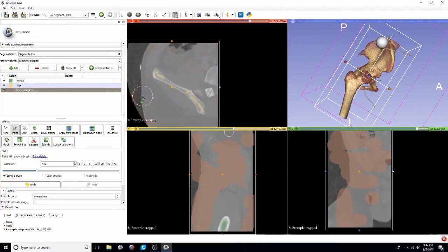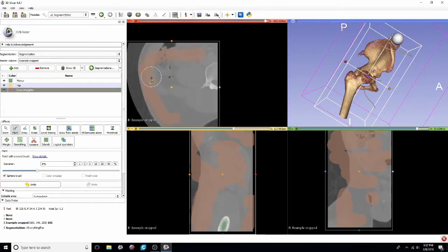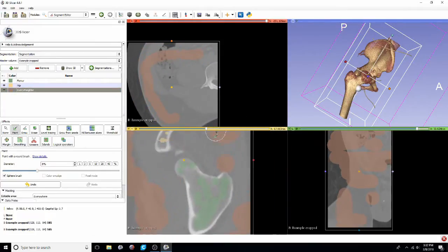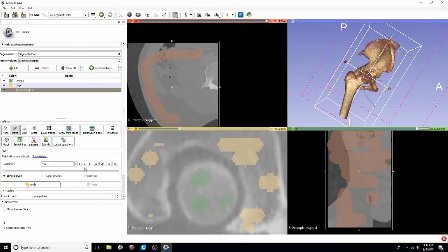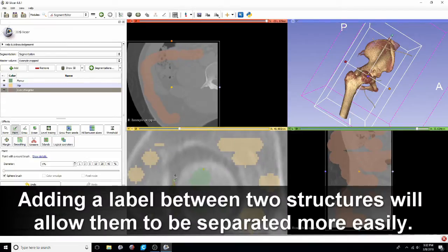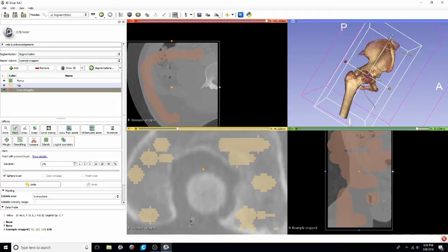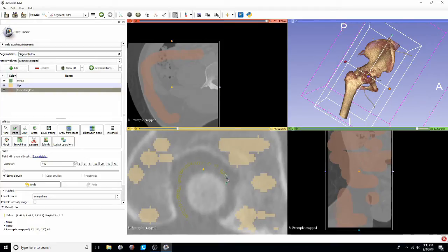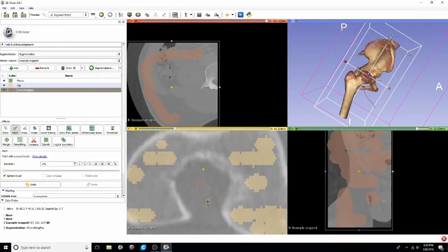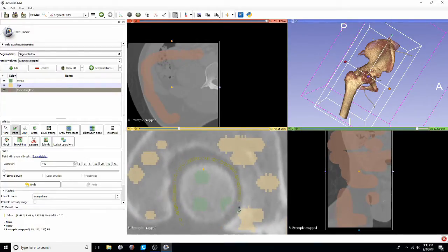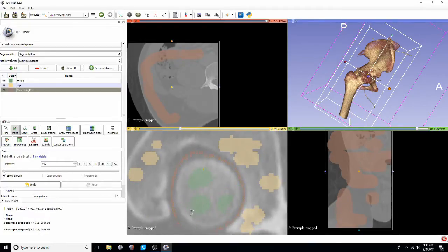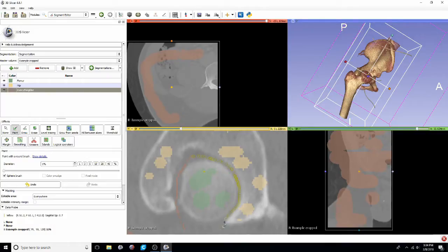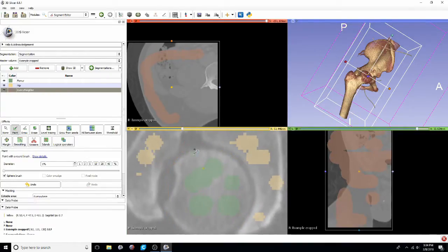But don't go too crazy with spending a ton of time. I've also found that adding a label between two structures allows them to be segmented out much better. It really gives the computer an idea of where that femur ends, what is in between them and then where that hip starts. The computer will kind of automatically figure out that everything else is the less bright structures. The femur is this brighter structure and then the hip is the other bright structure, but on the other side of that everything else label.